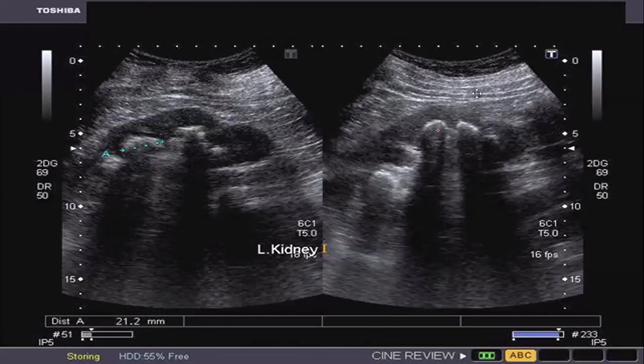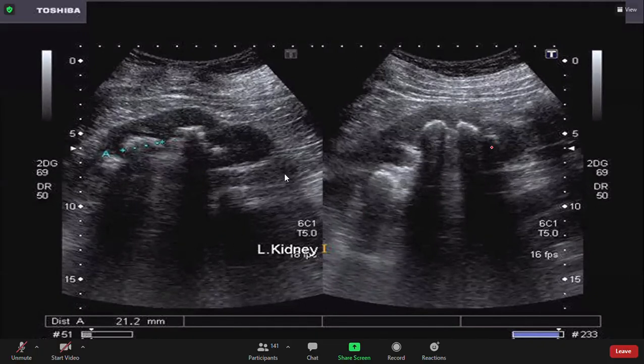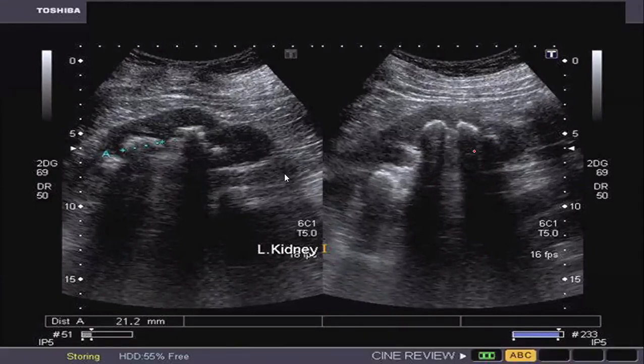This is the shadow of the stone. Actually, the stones are there, only that they are shadows. I will explain to all of you next time why a typical stone, whether a stone in the kidney, the urinary tract, or the gallbladder, would develop a posterior sonic shadowing.